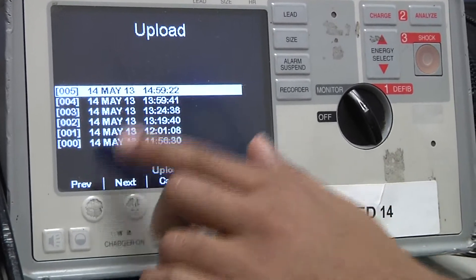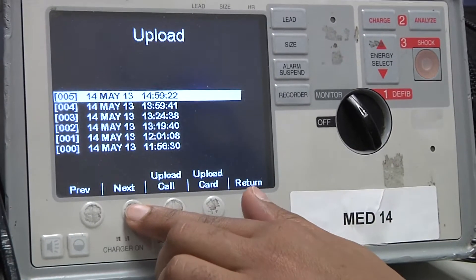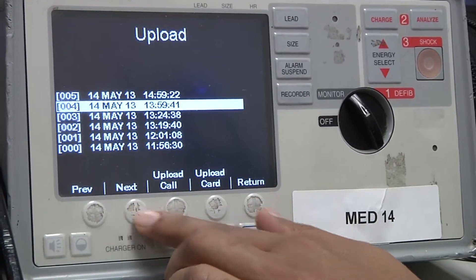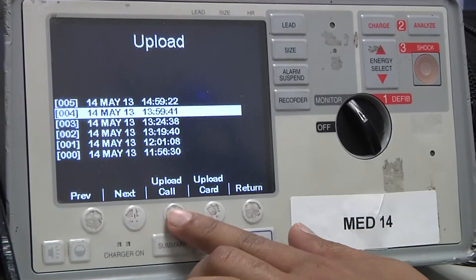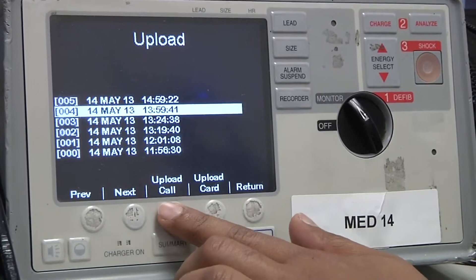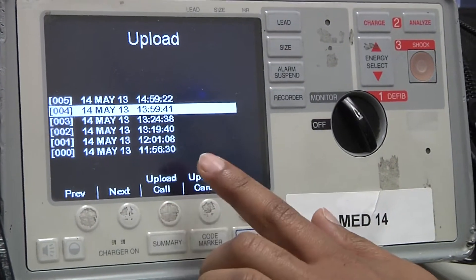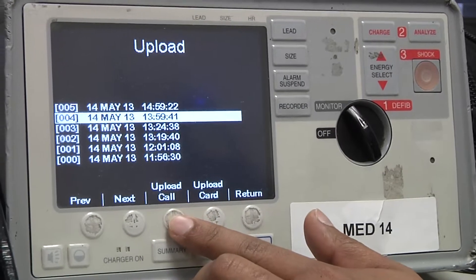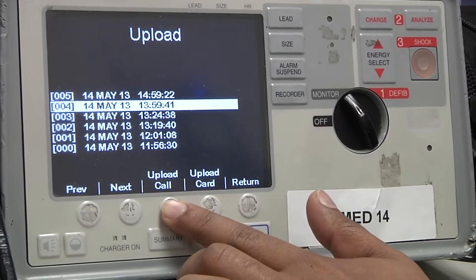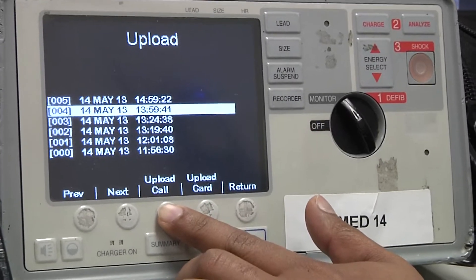I'm going to select one case, click next, and then select upload call. Normally you would select upload card, but I'm just going to upload this one call so that it'll go quickly.